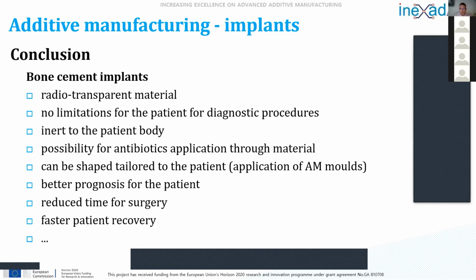After maybe a few such cases, the application of this type of implants and additive manufacturing in medicine generally decreased quite fast, and you have to prove that this technology is good after another maybe 50 or 100 good examples, so that you can get the trust in those technologies again, like the trust that existed before those cases.